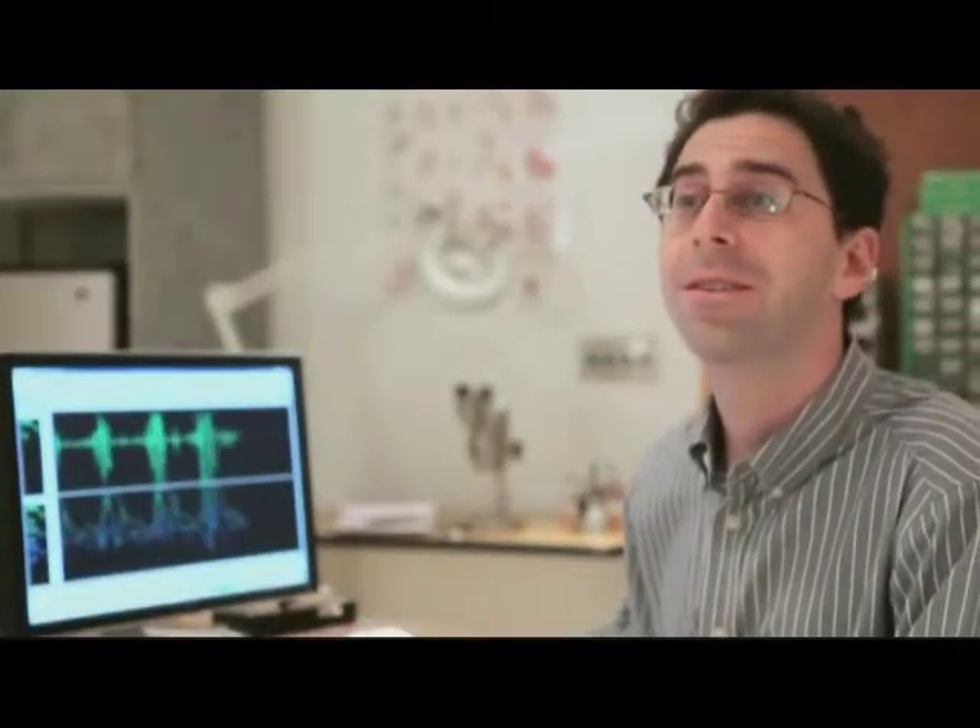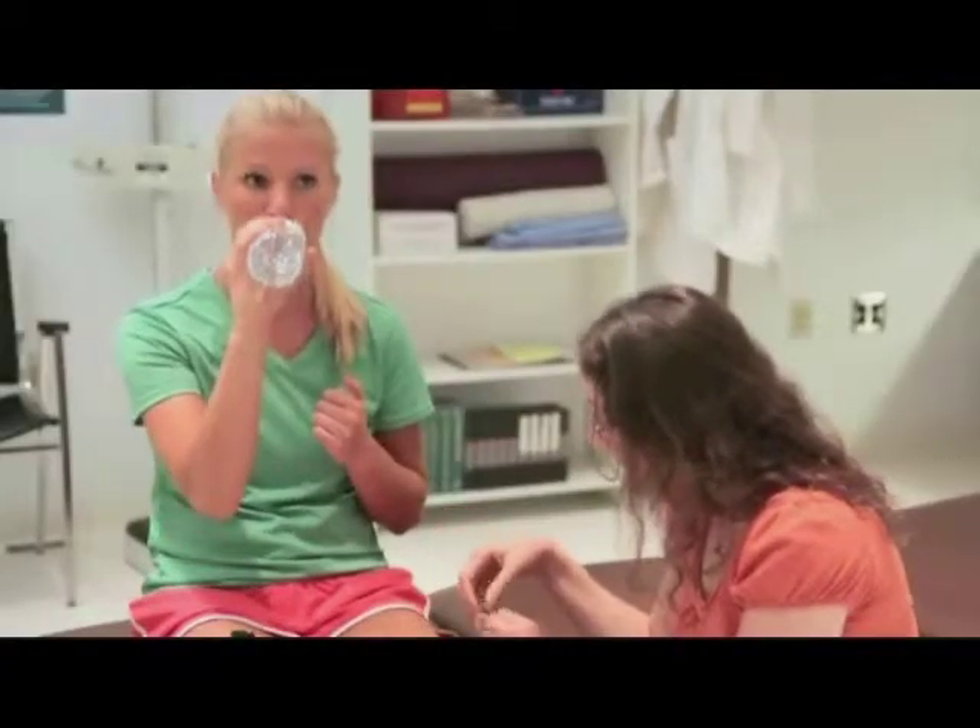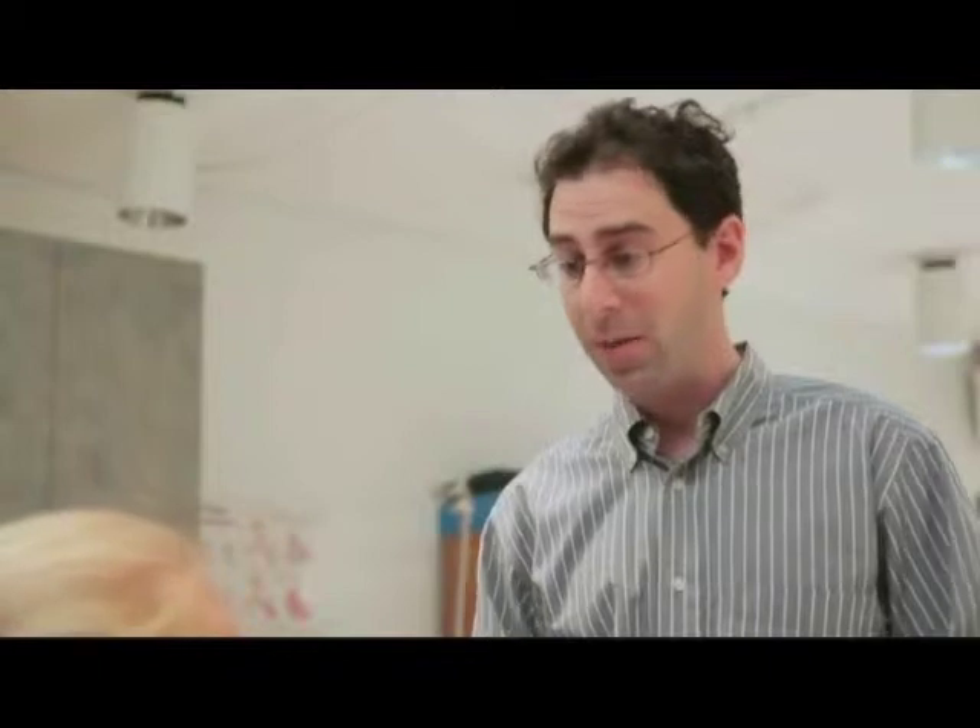Monica is told she can rest. Dr. Walker notes that their last session is coming up, saying Monica has come a long way and that it will be great to gather data while she is performing an actual sports activity.